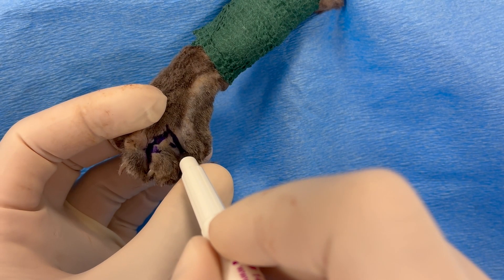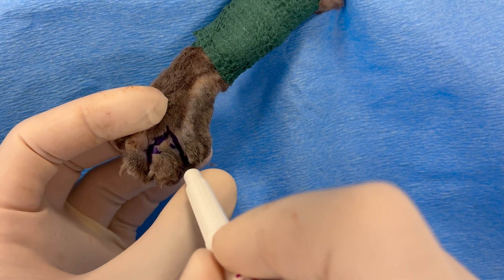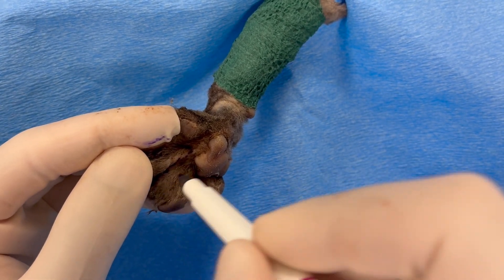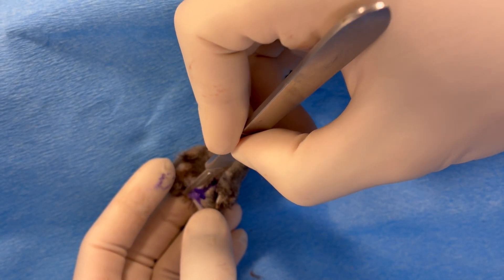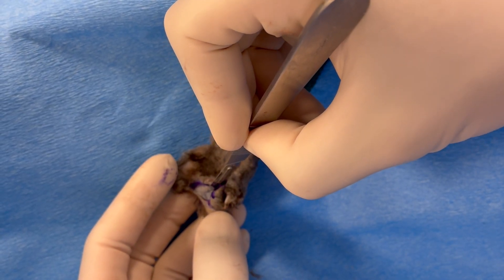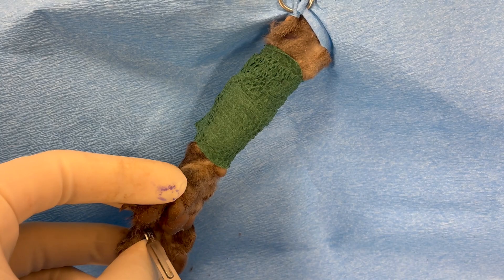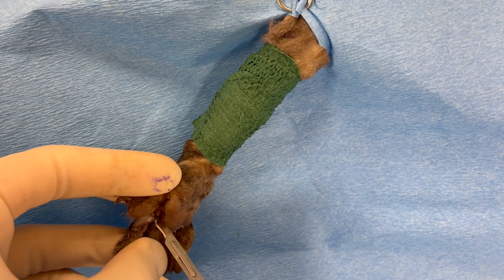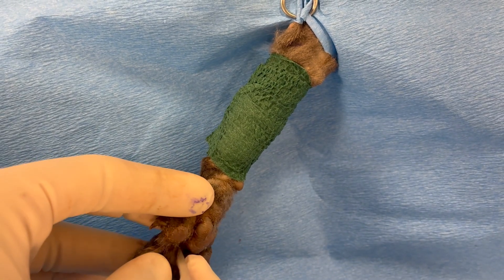In this example we are going to excise digit four at the metacarpophalangeal joint. A marking pen is used to delineate the site of excision, which is essentially mid interdigital webbing in an inverted V-type configuration. However, the tissue margins are often dictated by the local pathology.